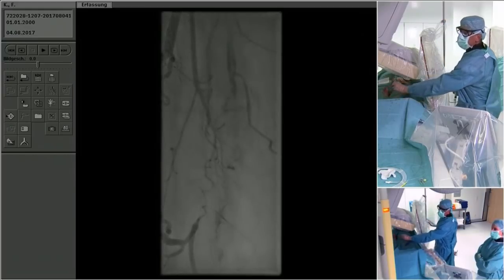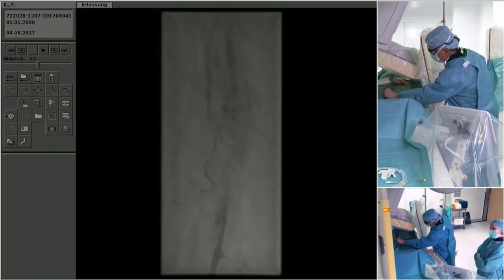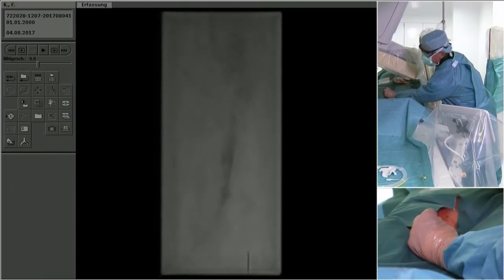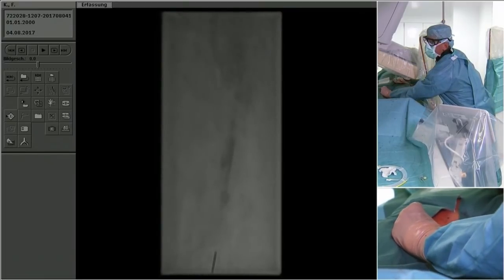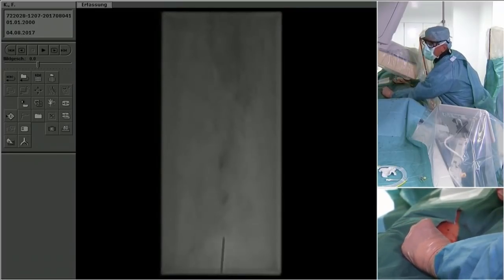Right, but what I'm trying to understand, because this comes up all the time, is why not try endo first, if he's not going to take your surgical option away? No, because of the nature of the procedure. He says it is disconnected, which I doubt, by the way, the way the bypass is. Oh, because of the transection, that's why you say that. Yes, this is because of the transection, that's all.